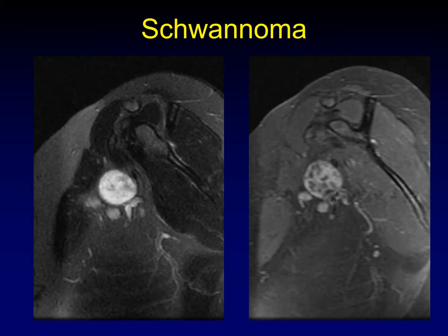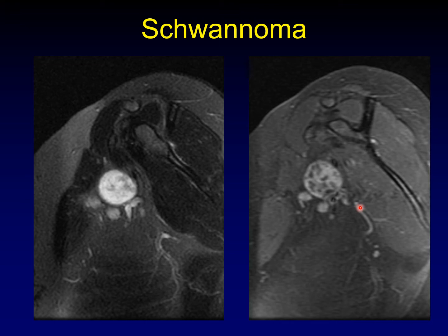The most common neoplasm we encounter in the brachial plexus is a schwannoma, and a schwannoma in the brachial plexus looks just like a schwannoma everywhere else. It's going to be bright on T2 and heterogeneously enhancing on post-contrast imaging. These tend to be elongated oval objects. So if it looks like the schwannomas you see everywhere else but it's in the brachial plexus, it's probably a schwannoma of the brachial plexus.